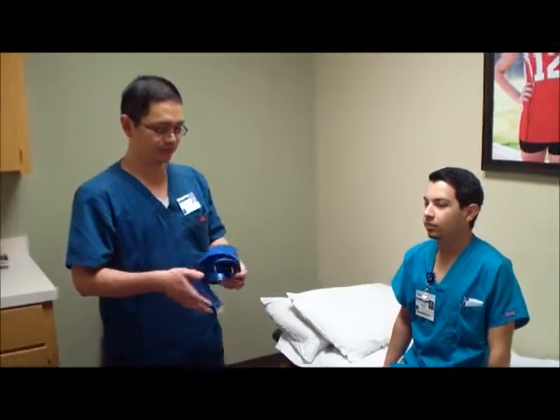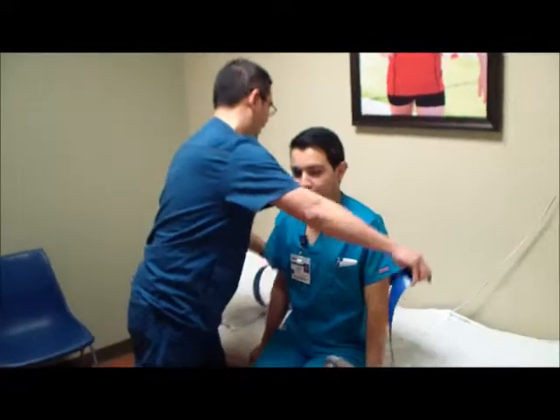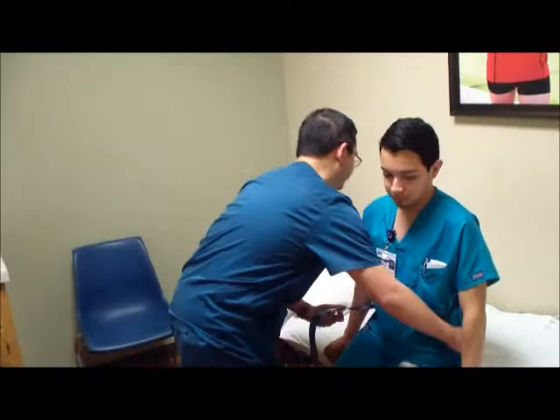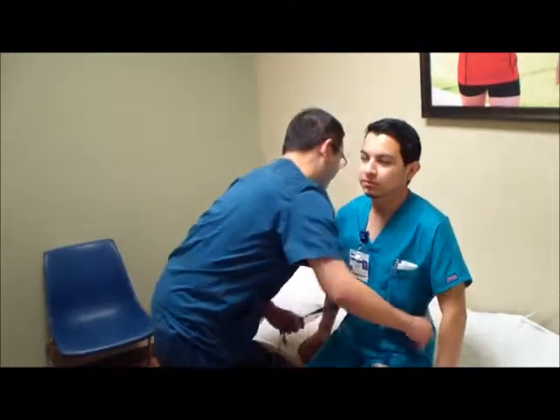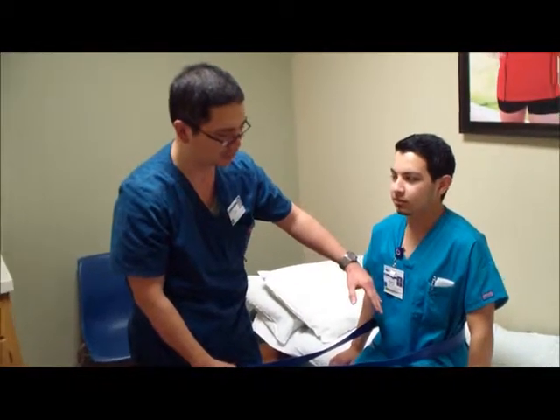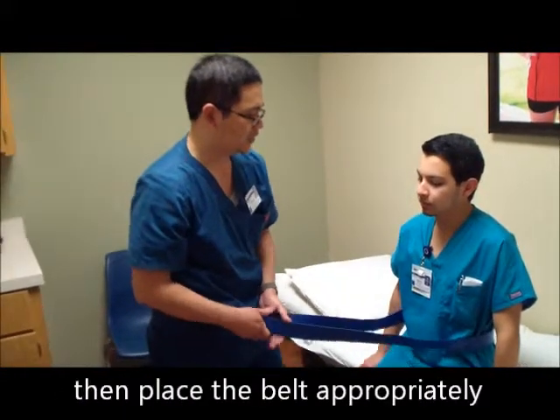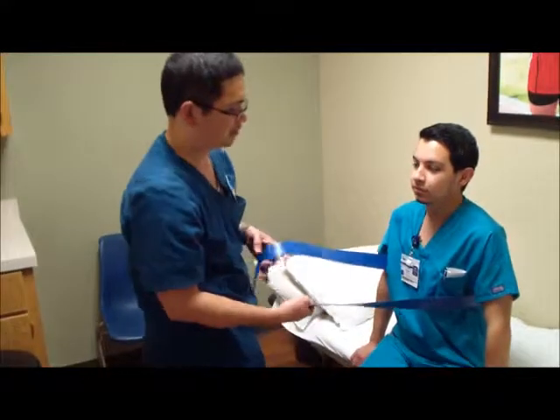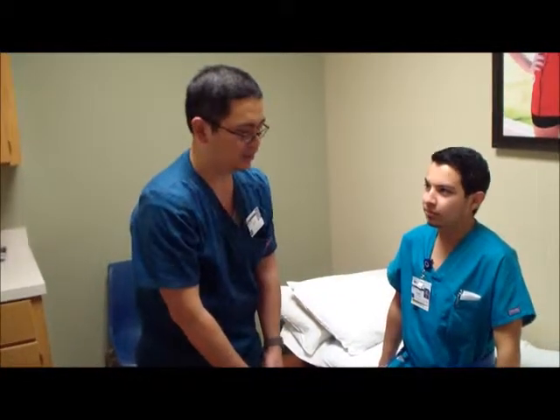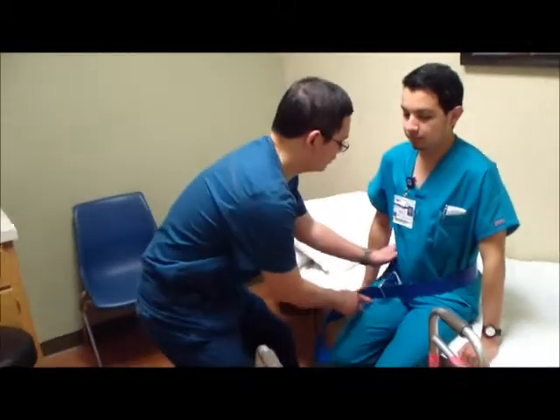So next, putting on a gait belt, you would want to make sure that the gait belt is secure. Right now I'm going to put a gait belt around Matthew, who is a patient, for example, who had surgery in his belly. When you work with a patient who's had surgery in his belly, you would want to avoid putting pressure on the incision when you tighten the belt. We could either put the belt higher up above the incision, or lower, to where the belt doesn't touch the incision. In this case, I'm going to put the belt really low.